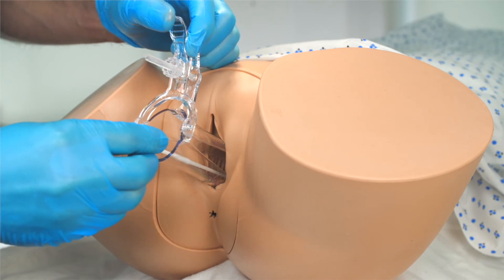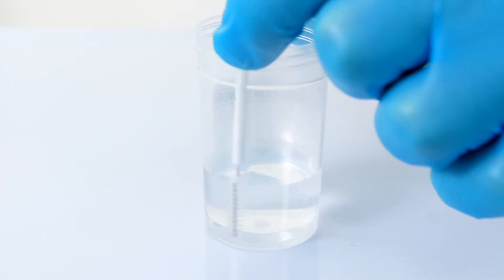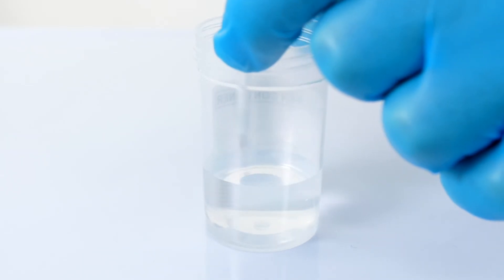We can then remove the endocervical brush, taking care not to touch the speculum with the brush as we do so, before depositing the endocervical cell samples into the cytology specimen pot by gently swirling the brush within the fluid, as demonstrated here.